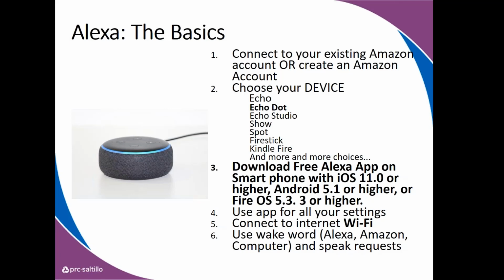If you want to have a separate account, like I sometimes see for educators, maybe you have a different education account if you're using that in the classroom. But for home, you just attach to your existing Amazon account because you're shopping. And then you need to figure out your device. I love folks talking about Fire TV and independence. Yes, for complex bodies too. Yes, I love it. Thank you for sharing.